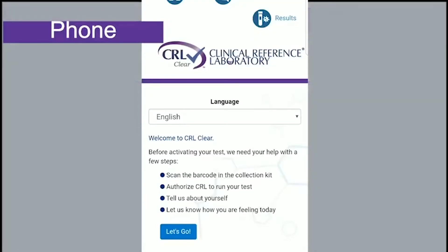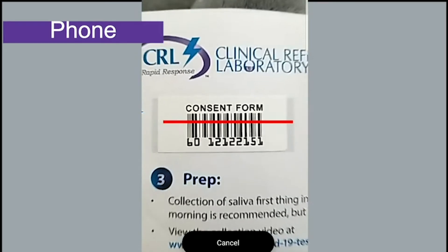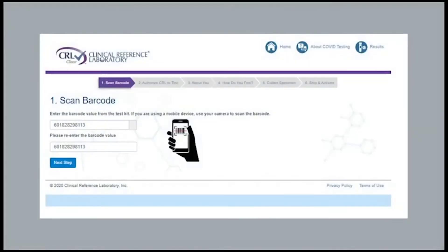To begin the online process, click on the Let's Go button. On the next screen, tap the Barcode Scan button and hover your phone's camera over the barcode label. If you are using a computer to register your kit, you will need to hand-key the barcode.